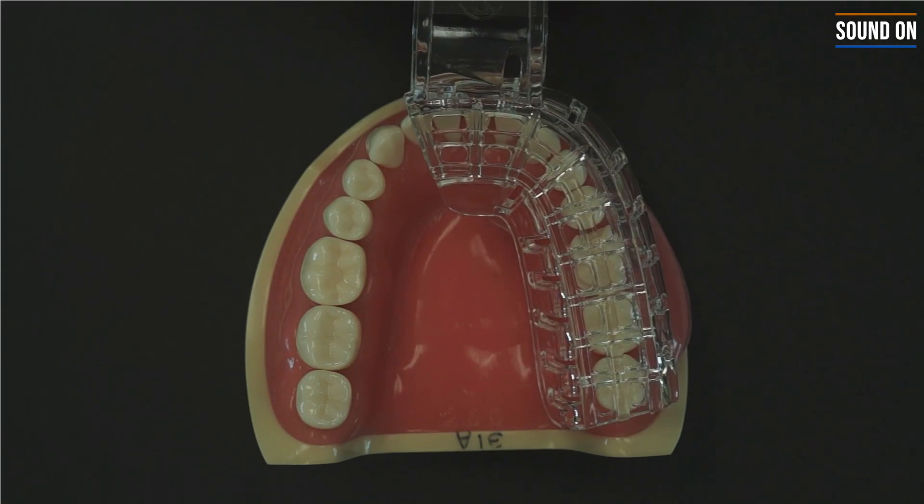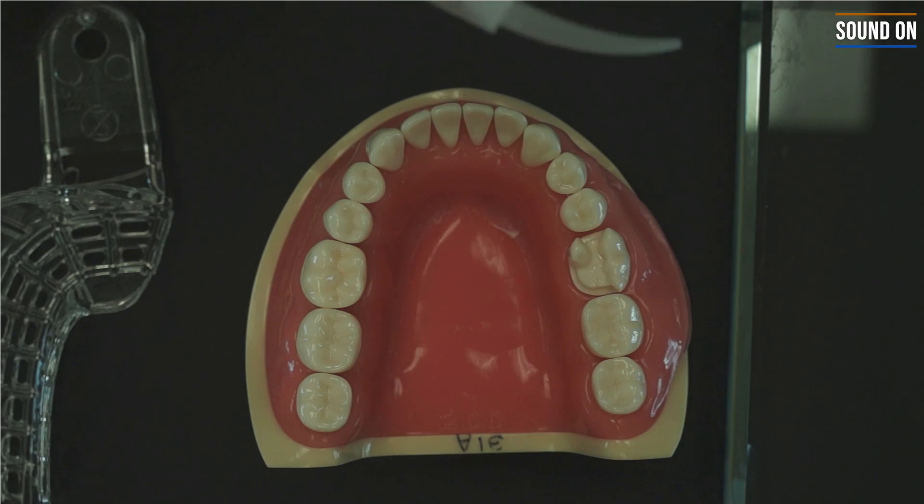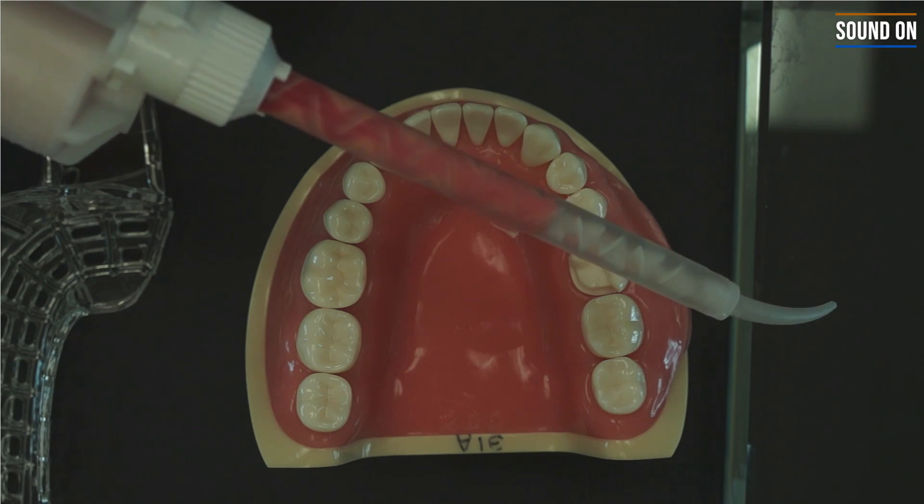This first exercise is pretty straightforward. You have to make an impression of this onlay prep on tooth number 30. First, you have to test the partial tray. Then, you're going to start making the impression.